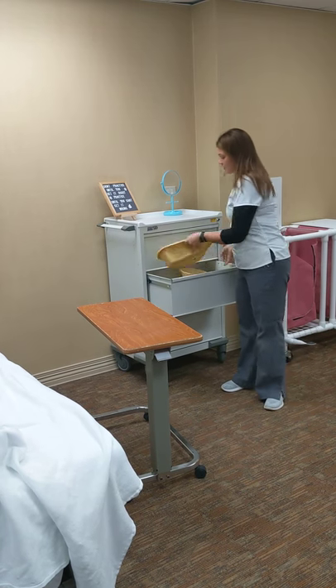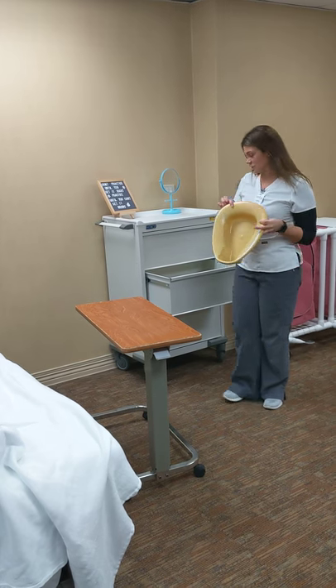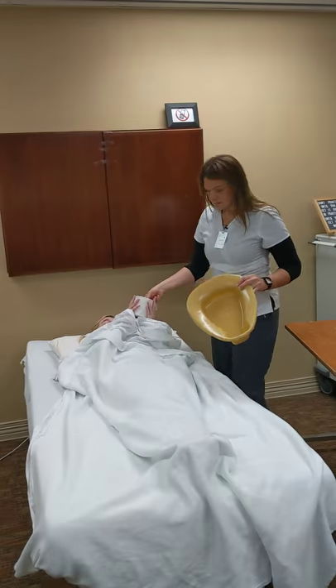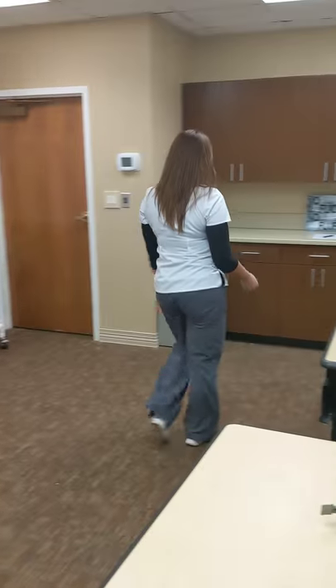And then you have a regular bedpan. This part goes to the foot of the bed, and this part goes under your patient. We're going to need toilet paper right now. And you can set your bedpan on the bed. And you need some gloves.